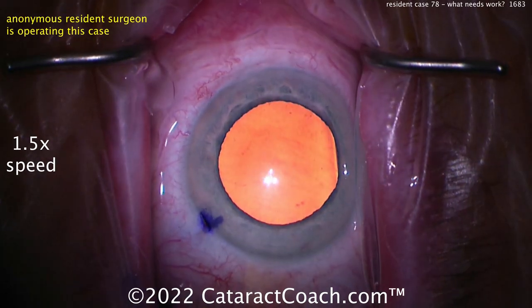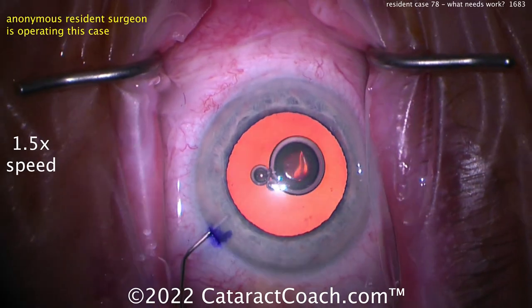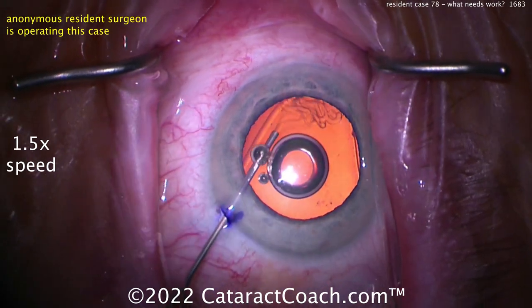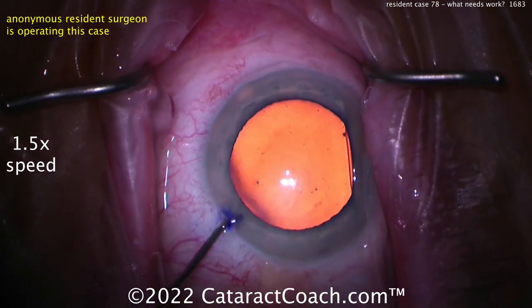I like it. Those are the paracenteses — notice how a little ink was used to help find that paracentesis. You can put that ink on the blade, that makes it easy. Here comes some probably phenylephrine, lidocaine, epinephrine, something like that. And here comes the viscoelastic — nice fill, good fill.